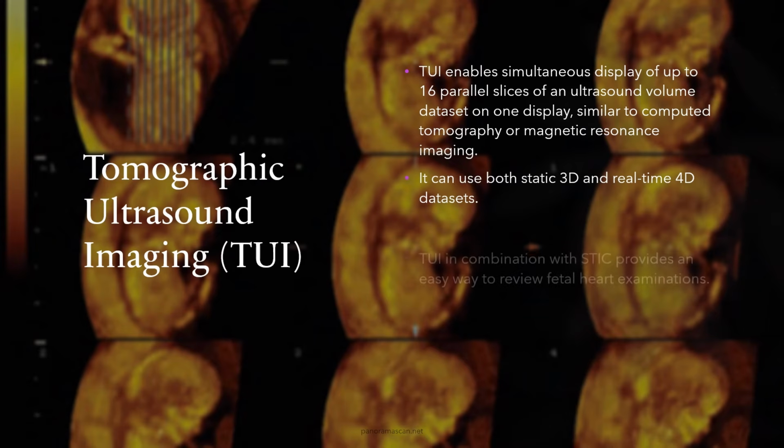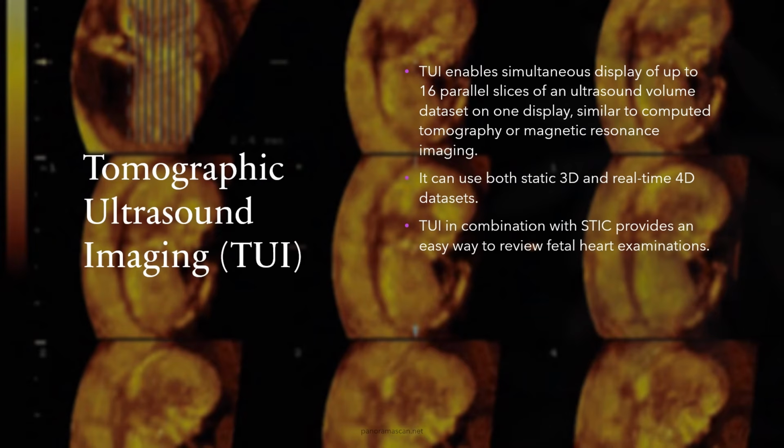When combined with STIC, TUI is highly effective for fetal heart examinations. By displaying multiple slices of the heart in real time, it provides enhanced evaluation of fetal cardiac anatomy, assisting in the detection of congenital heart defects and structural anomalies.